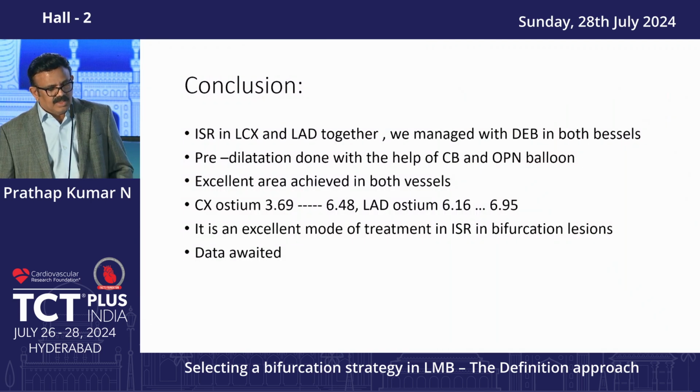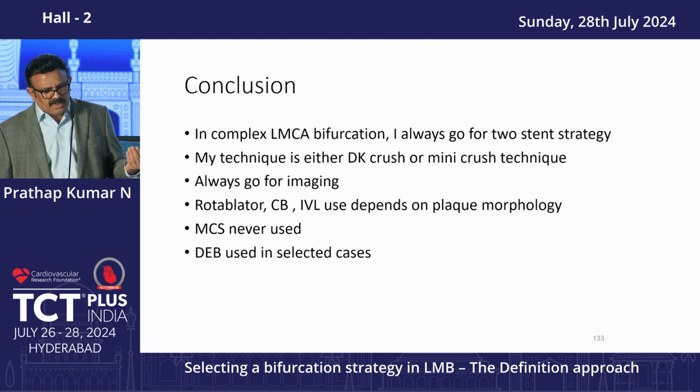Patient is doing very well. So ISR in circumflex ostium was 3.69, became 6.48. LAD ostium 6.9. An excellent mode of treatment in ISR. So drug-coated balloon is actually one thing. In complex bifurcation, my point is 2-stent strategy.